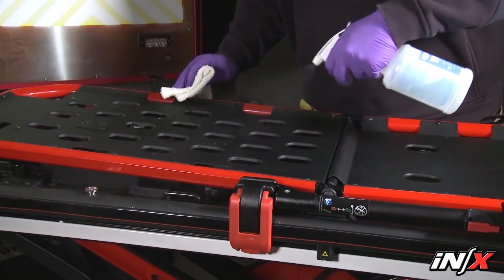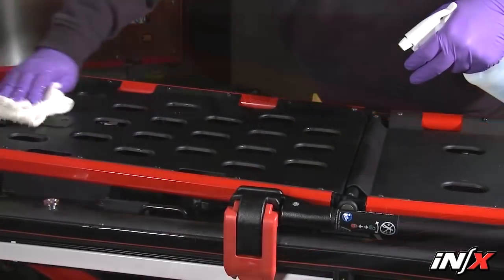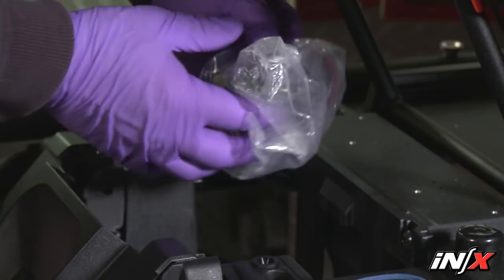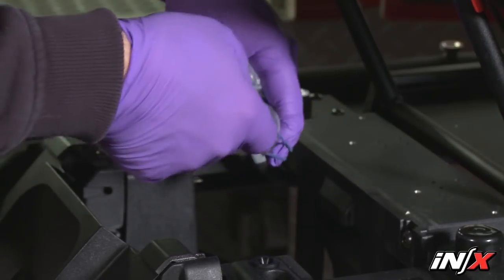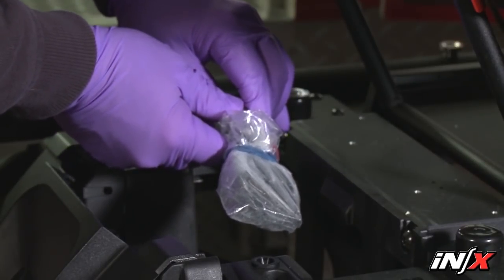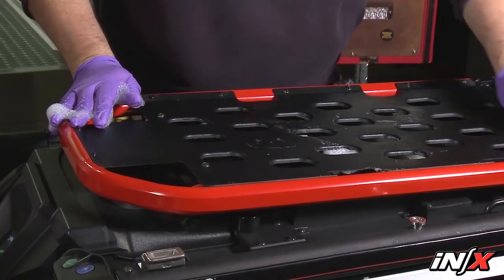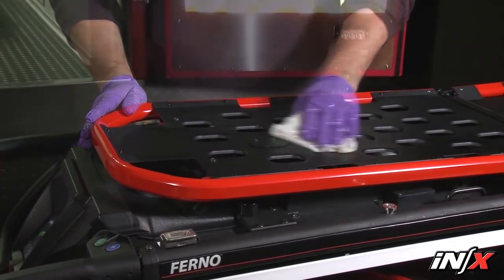To disinfect the NX, wipe all surfaces with disinfectant, following the manufacturer's instructions for application method and contact time. FERNO recommends you visually inspect the NX for damage as you disinfect it. To clean the NX, remove the battery and cover the plug on the battery connector cable with a bag. Tie the bag closed or use a rubber band to make a watertight seal over the plug. Verify that all cords, cables, and connectors are connected. Do not spray water directly into ports, wire harnesses, or cable connections. Remove the patient restraints, pad, and any accessories. Hand clean all surfaces with warm water and a mild detergent, or pressure wash the NX within the described limits. Rinse with warm, clear water. Dry the NX with a towel or allow it to air dry.